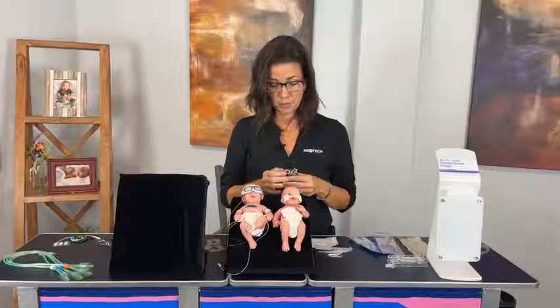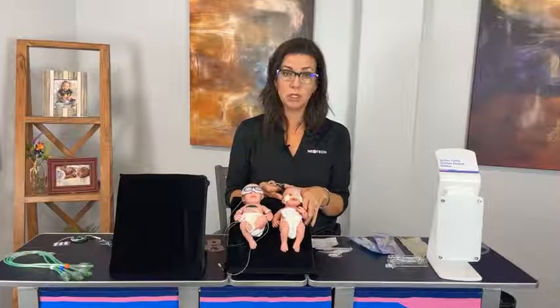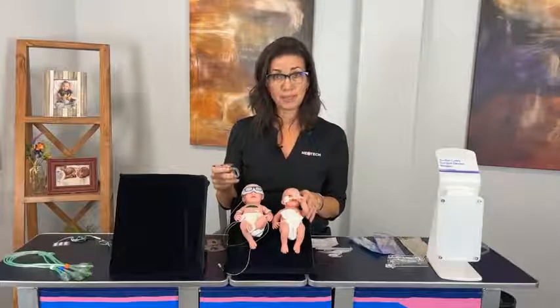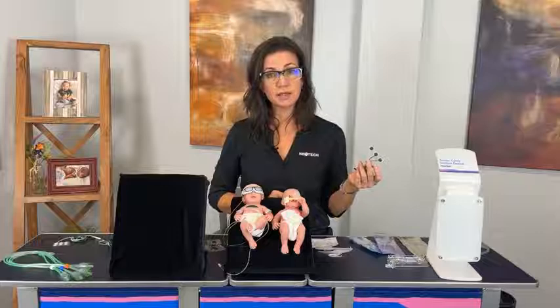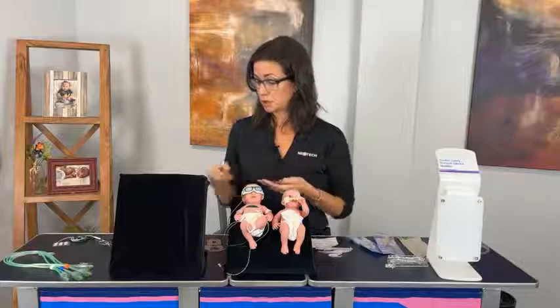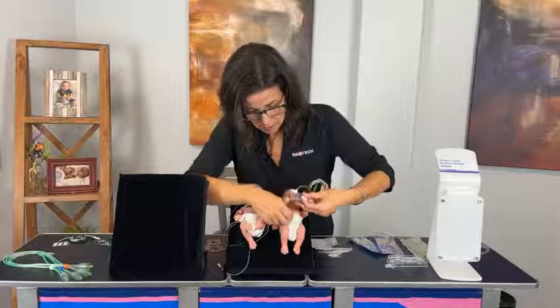Okay, I did mention that the application process for our electrodes is a little different than your standard electrodes because of the hydrocolloid. So we want to start with clean, dry skin per hospital protocol. Don't use alcohol. Before we peel the lead from the plastic liner, we need to heat the hydrocolloid. If you do not heat hydrocolloid prior to application, it will not adhere properly. You can hold it up to a radiant warmer for 10 to 15 seconds, or you can use a heel warmer like I have today, and you hold it in your hands for 10 to 15 seconds. If you don't have either of these options available, you can hold it in your hands for about 60 seconds. Then one at a time, we're going to take our leads and apply them to the patient.